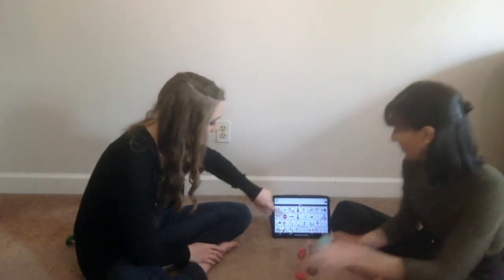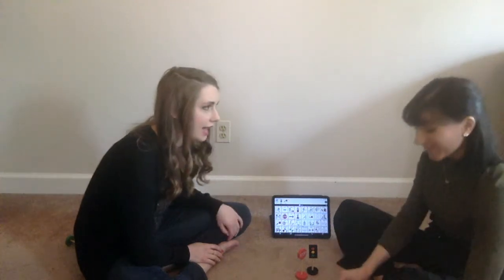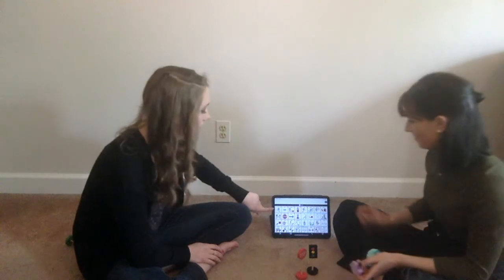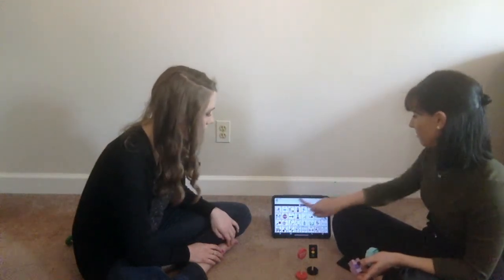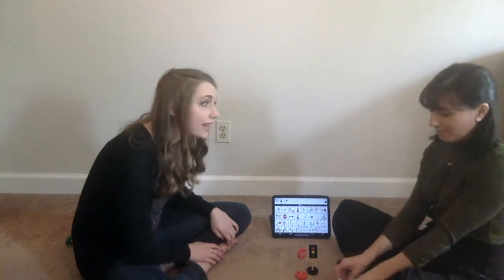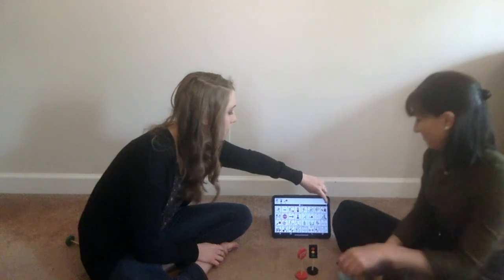Alyssa. I like it. I like that. Do you like that? You can say it too. I like it. You like those toys, Alyssa? Nice job playing. So that's a way that we can comment and talk about what she's doing.